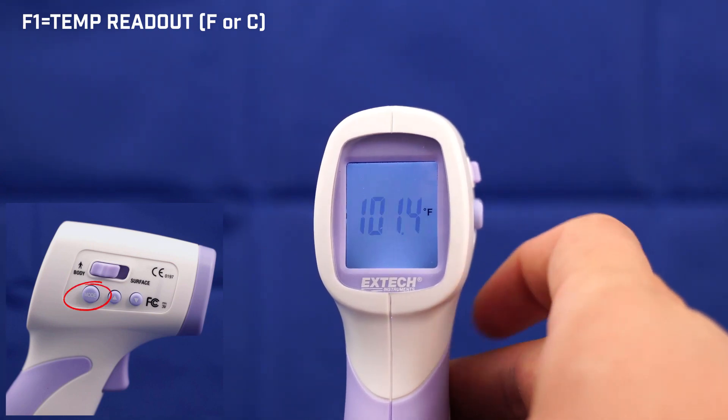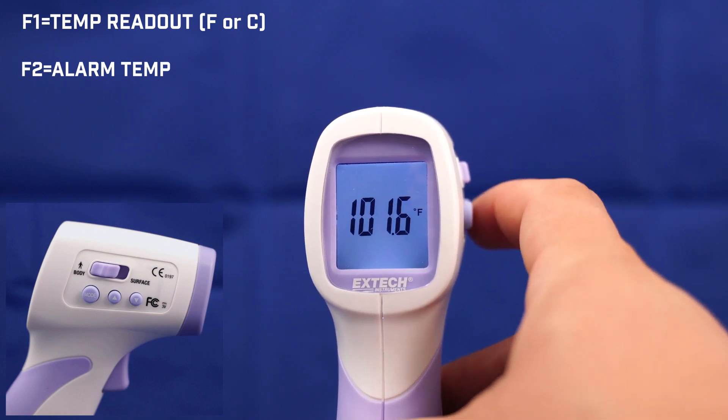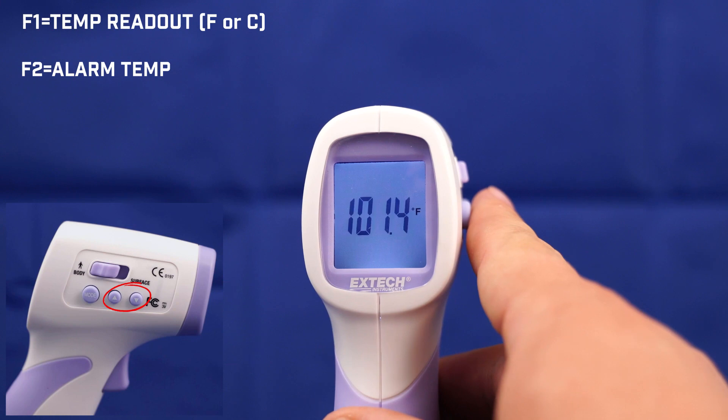Next, we will go to our alarm temperature in F2. From here, we can adjust at what temperature the alarm will sound on the XTEC IR200.